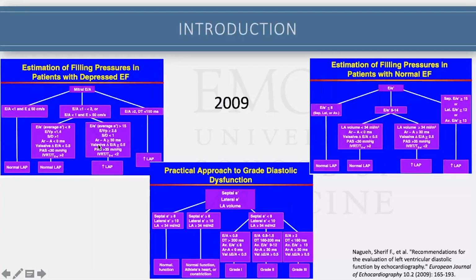among parts of the assessment, I don't know if you can see my mouse here, looking at the Valsalva change and E to A ratio, looking at more challenging measurements like the isovolumic relaxation time divided by the time between the E and the E prime waves. So the fact that these would all be routine parts of assessment was new to me. It was interesting, and it was the first stab at understanding how we can use echo to measure diastology. A lot more to come on that in a second.